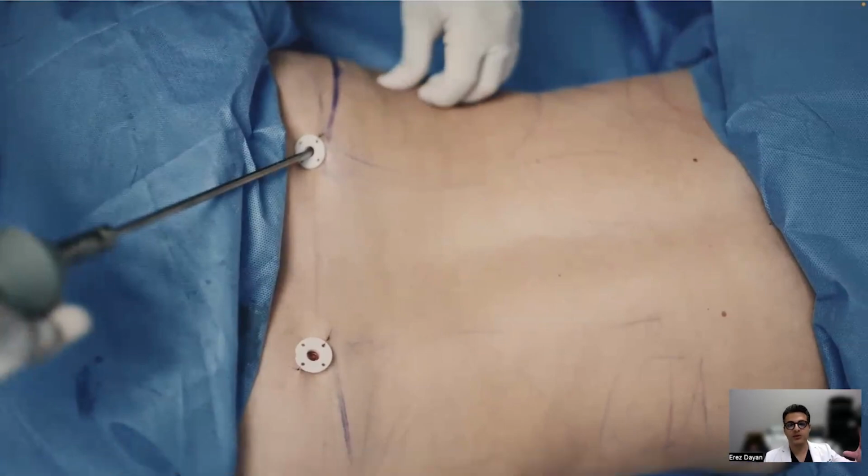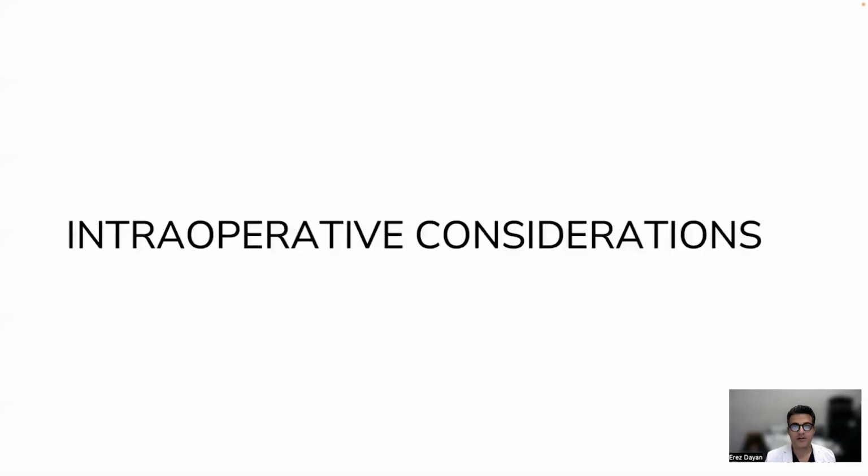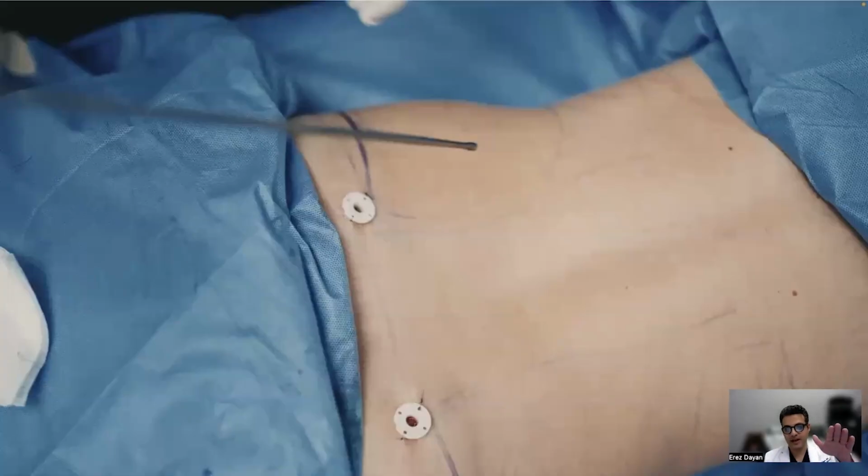One way is you hold the subcutaneous tissue up like a hot dog almost, and you're suctioning around the borders of that. And then you can pinch with your left hand to get a sense of what that subcutaneous tissue is like. Another way to do it is to hold your hand on the skin like a flat plate and then liposuction underneath so you can feel what the skin thickness is and where your cannula is. So there are different ways to do that, but you want to constantly be assessing where your cannula is and what the skin thickness and soft tissue thickness are in those areas to ensure that you're creating an even liposuction plane.